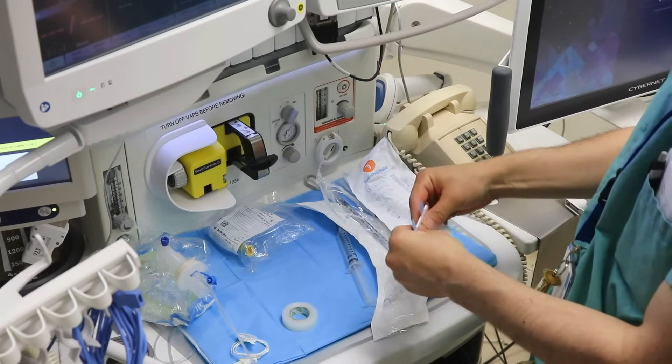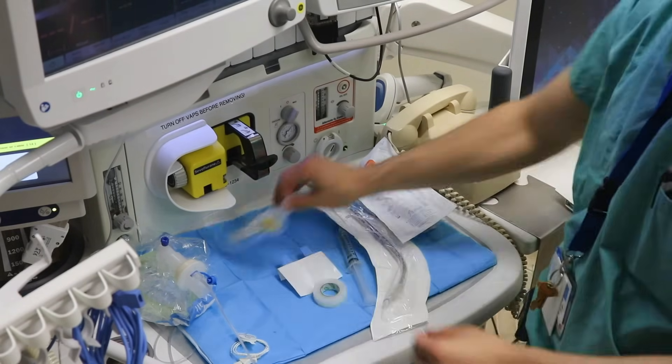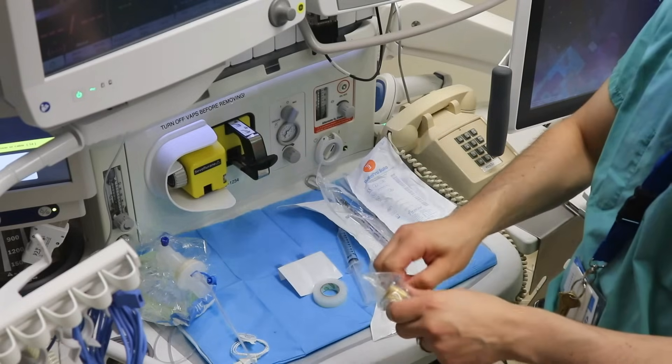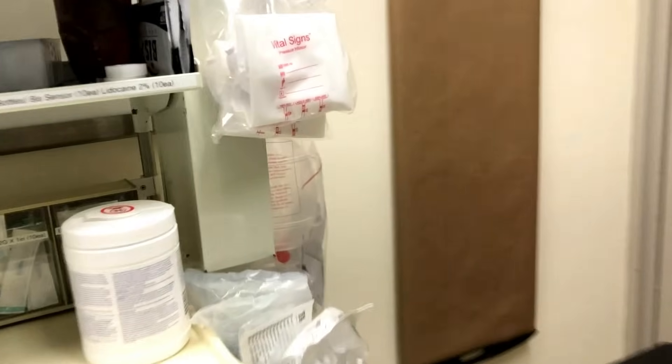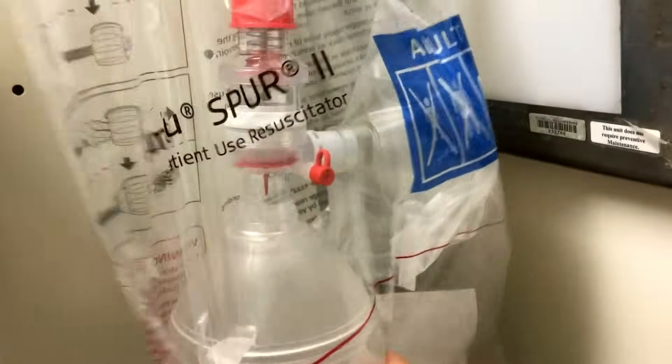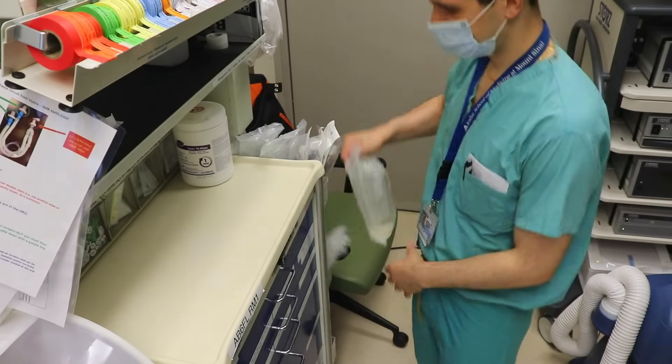I always like to have my eye tape ready to go — I tape a patient's eyes closed pretty much immediately after induction. I get my oral airway open so it's ready for use. The last part of my airway check is making sure my Ambu bag works. This can be an essential part of saving someone's life.